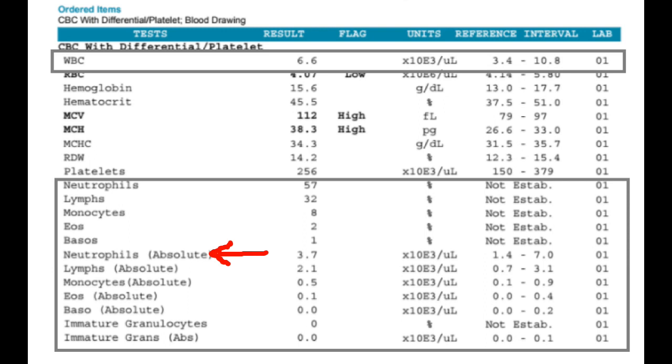Other things could cause differences and changes in the neutrophil count. I'm not going to go into that right now. Just know that mostly it's for bacterial infections. The eosinophil count and the basophil count, these two cells usually rise and drop together. They mostly, especially the eosinophil count, change in response to asthma or in response to allergies and parasitic infections and some other causes like drugs or fungal infections.